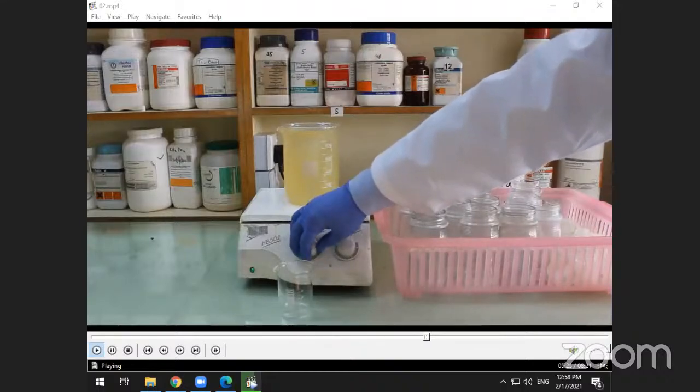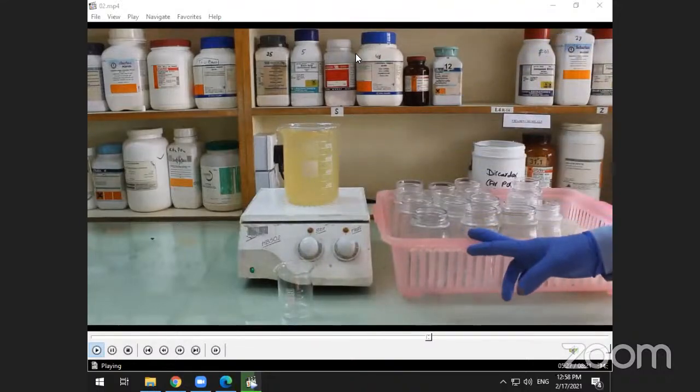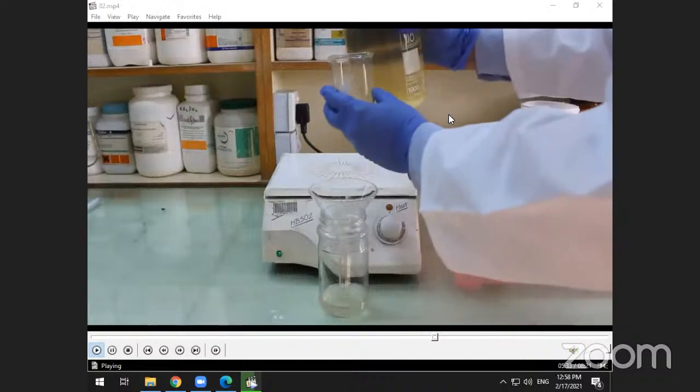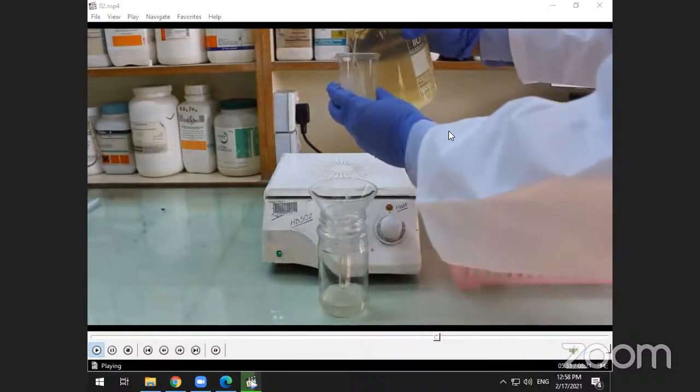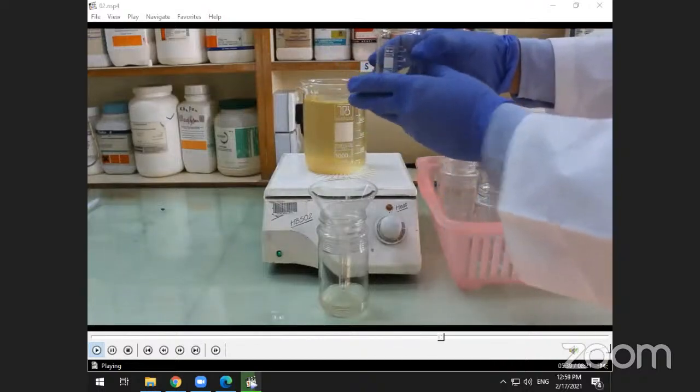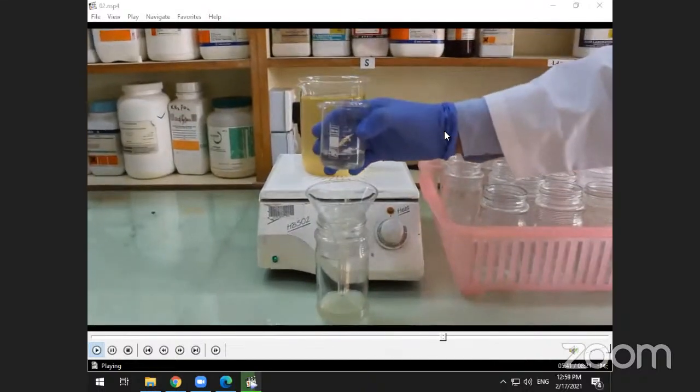Media is now ready to dispense in 250 ml glass bottles. Each jar contains a measured quantity of 30 ml of MS media.